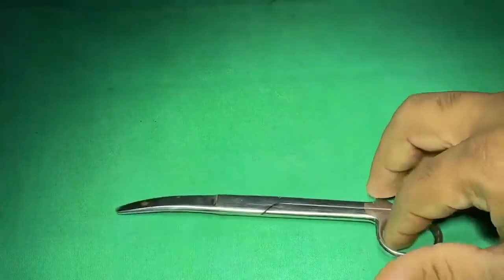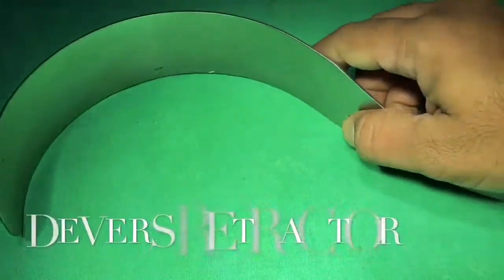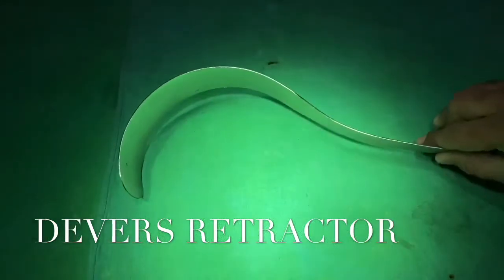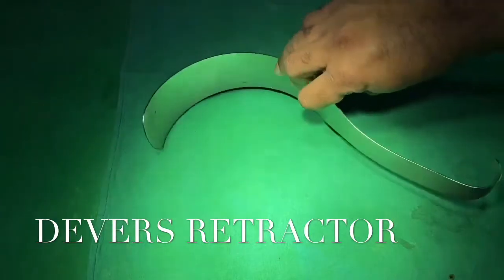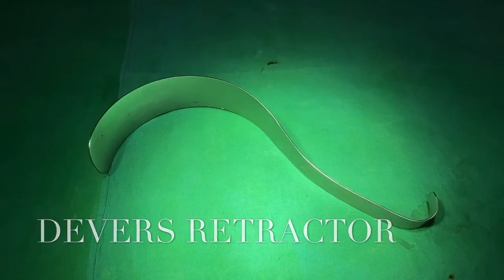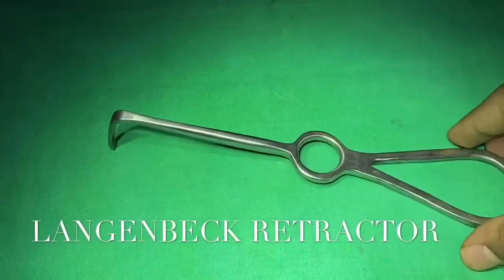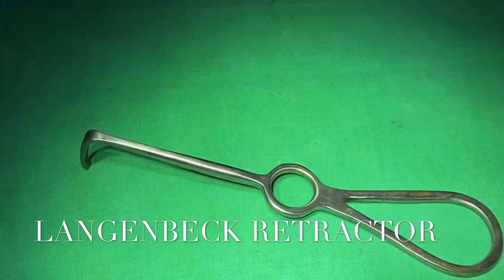This is a Metzenbaum curved scissor — you can get Metzenbaum curved and straight scissors. This is called a Deaver's retractor, used for deeper retraction because of its longer blade. It is used for deeper retraction in intra-abdominal surgery; for example, at open cholecystectomy it retracts the liver bed. This is a Langenbeck retractor, used for retraction in surface surgeries like thyroidectomy.